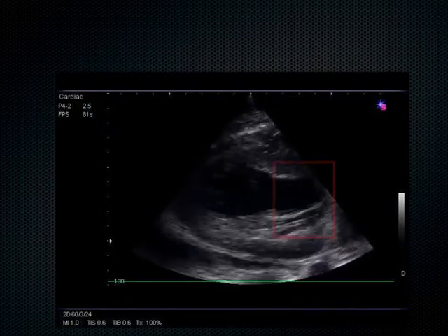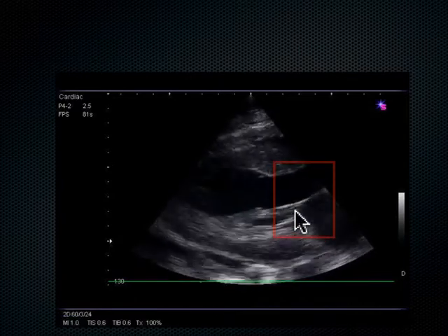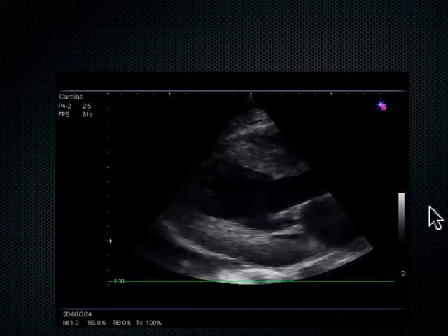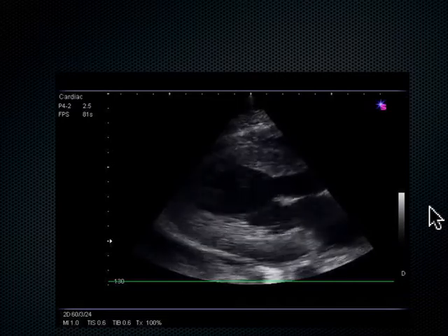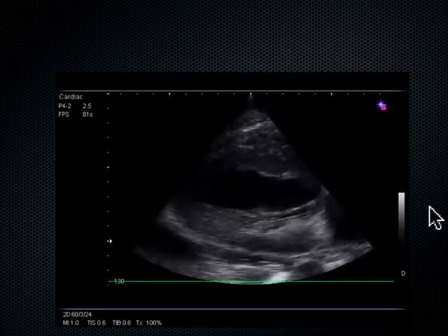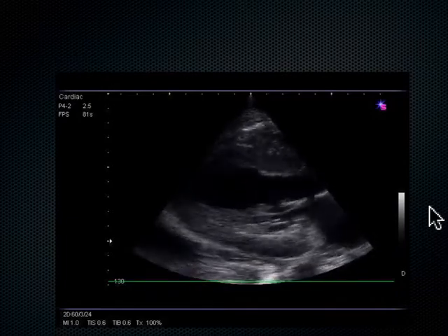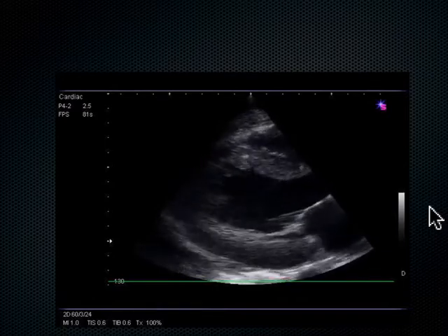Okay, what about this? How's that septal wall doing? This isn't the best view of the heart, but even though it's a little squished, I'm not seeing it come up here to the septum. Okay, so right off the bat, there's a problem. And by the way, the reason why I look at that is the physical mechanics of the flow of the blood going from the LA to the LV. As it's being sucked through that valve, it smacks that valve up against the septum. If it's going through with a good enough velocity to do that, good enough pressure change from that LV working so well, it causes that septal leaflet to smack the septum. So when it's not doing that, we know there's decreased LV function.